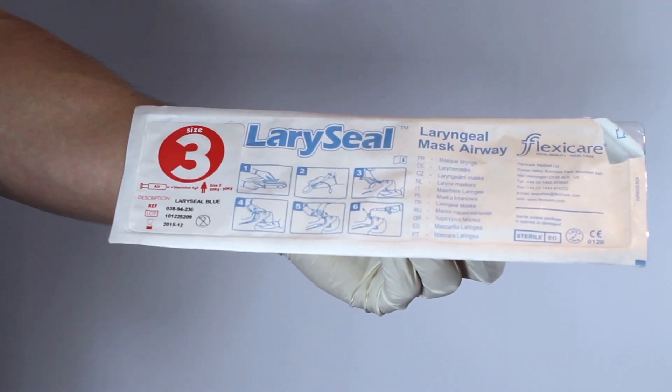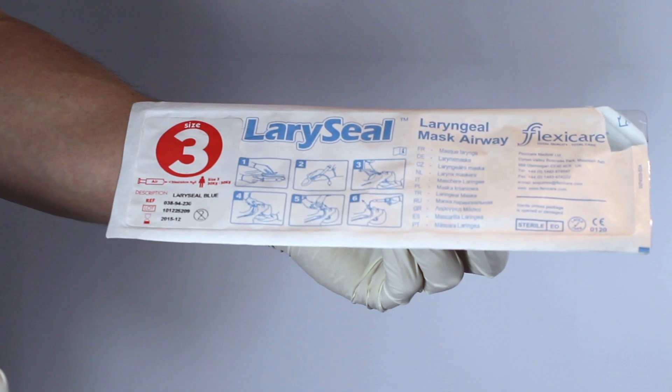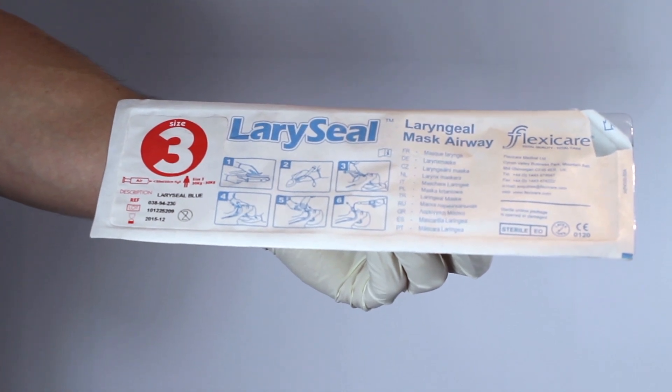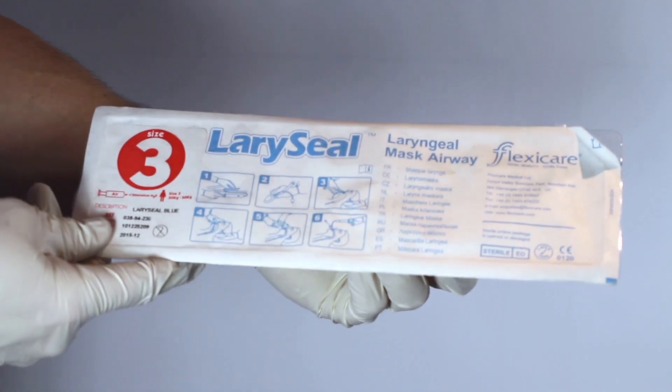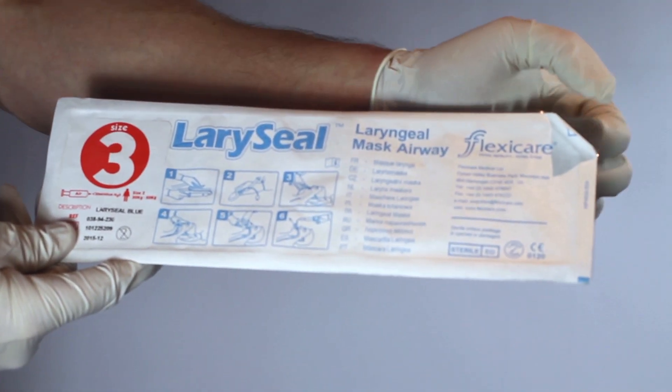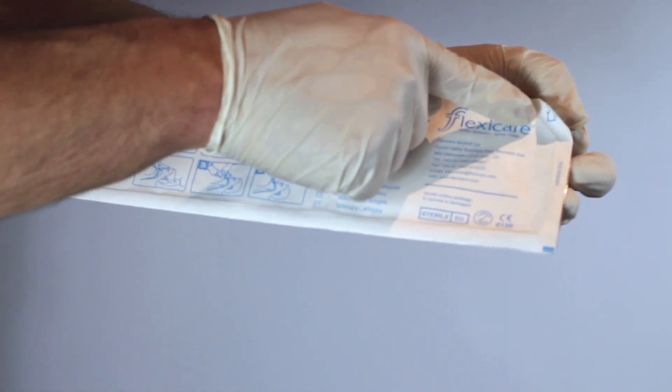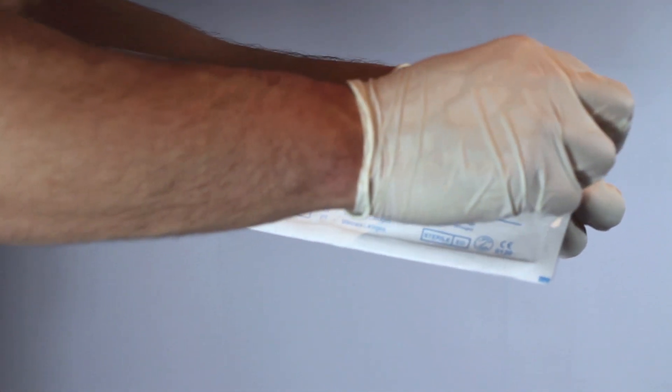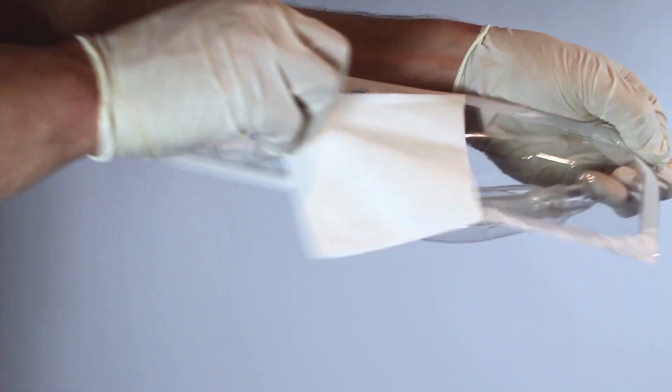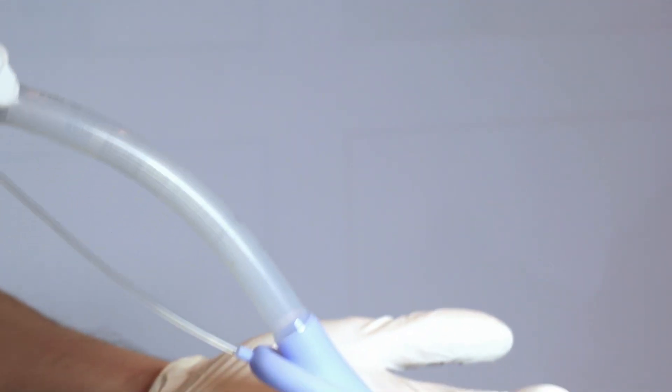When you have selected the correct size Laracel Blue laryngeal mask you will be ready to remove it from the thermoform packaging. First locate the peel here tab. Place the tab securely between your thumb and index finger with your other hand holding the clear formed shell of the packaging. In one smooth action pull the Tyvek cover back applying even force to each side. Laracel Blue can now be removed from its protective packaging.